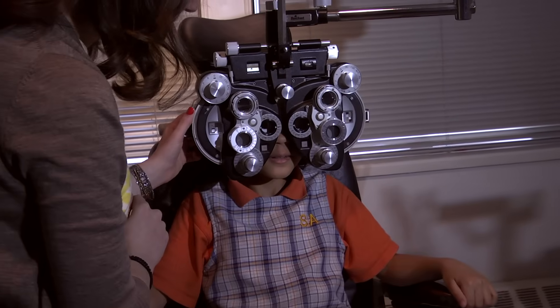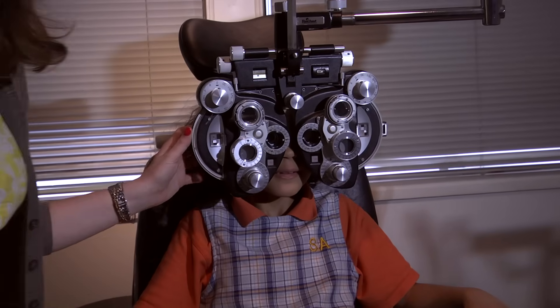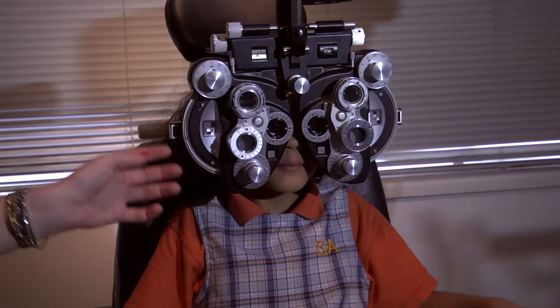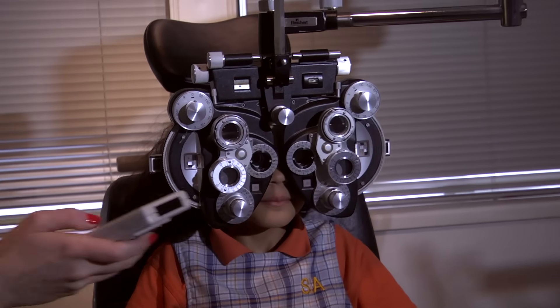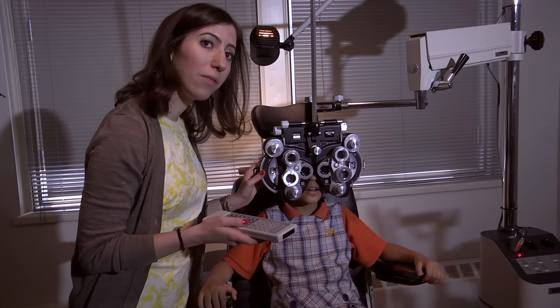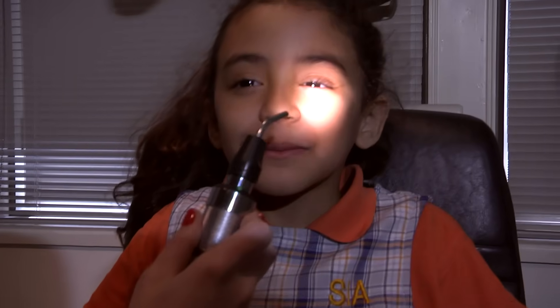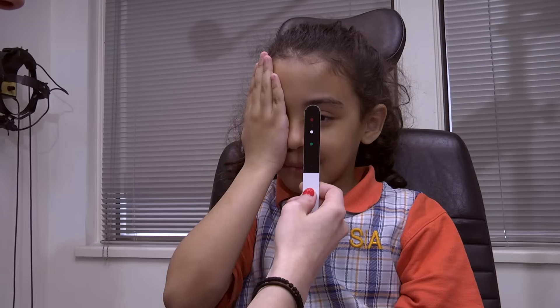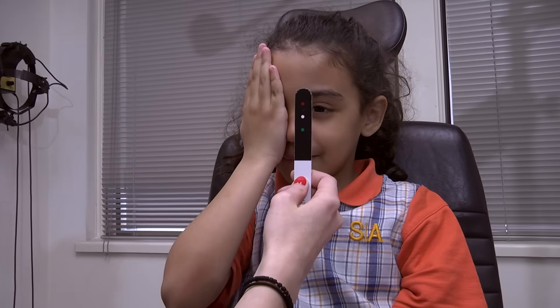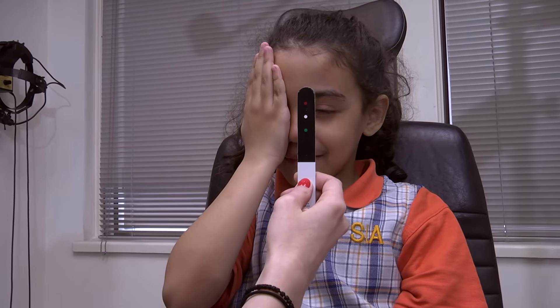In older children, it is similar to adults where we can put them behind the phoropter and ask them which is better, one or two. Based on a few different tests, we can have a good understanding of the child's glasses prescription if necessary.